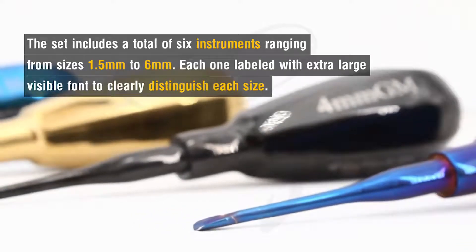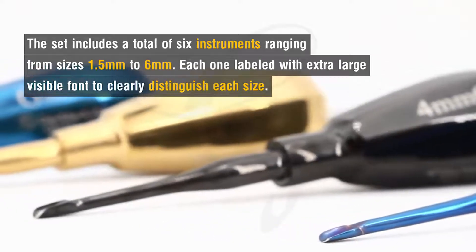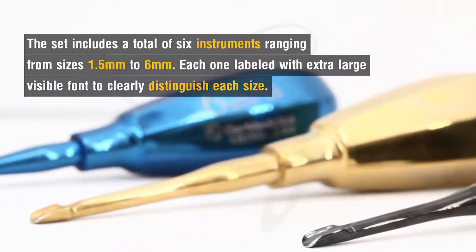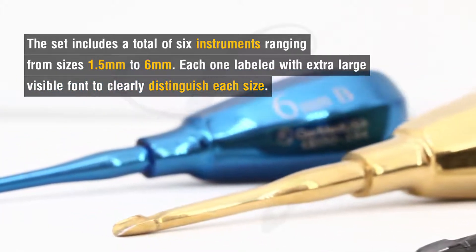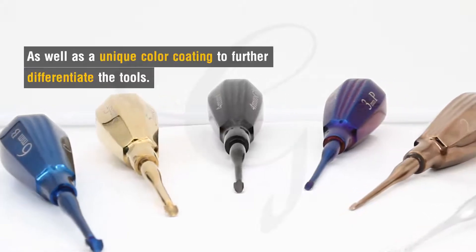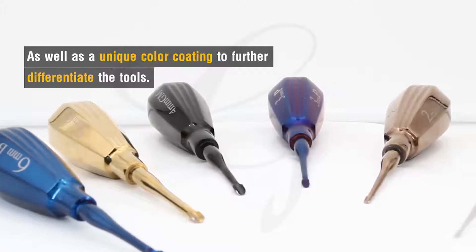The set includes a total of six instruments ranging from sizes 1.5 millimeter to 6 millimeter. Each one is labeled with extra large visible font to clearly distinguish each size, as well as a unique color coding to further differentiate the tools.